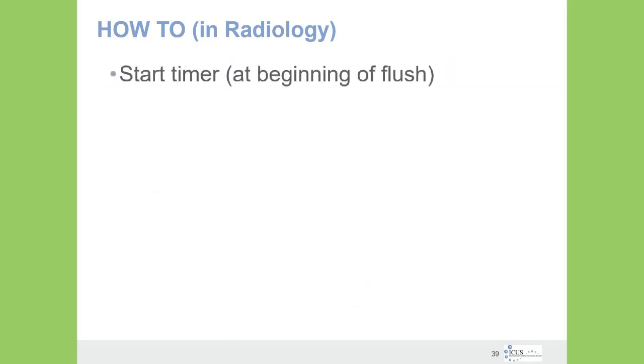We're going to start our contrast timer that we have seen in our various clips. We start that at the beginning of the saline flush. We're also going to start our clip save at that time so we don't miss any contrast bubbles coming in.